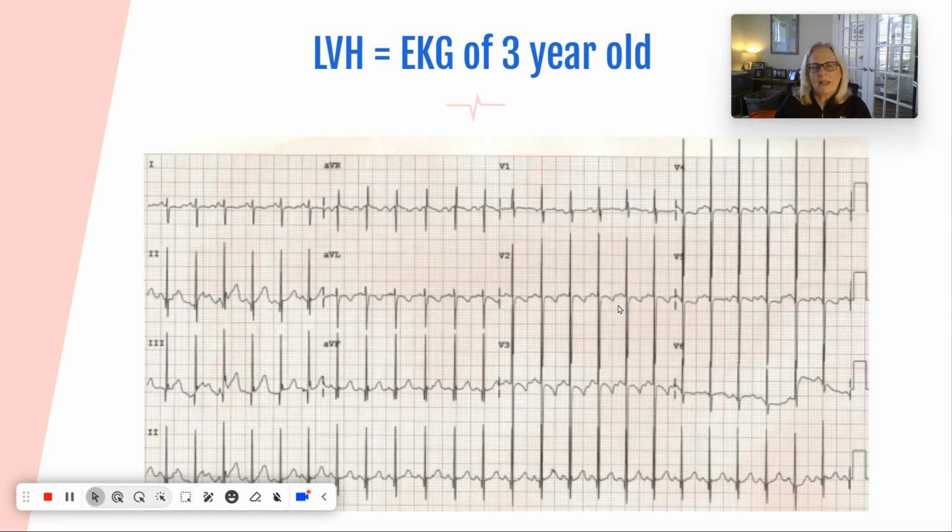But I can know right away that this is a kid's EKG, primarily because of that tall, skinny QRS and the inverted T waves, plus the heart rate's up a little bit. So that's a first indication to me that this is a young kid, okay? And if you weren't sure, rewind it and listen again. But tall QRS that's real skinny with inverted T's, child's EKG.